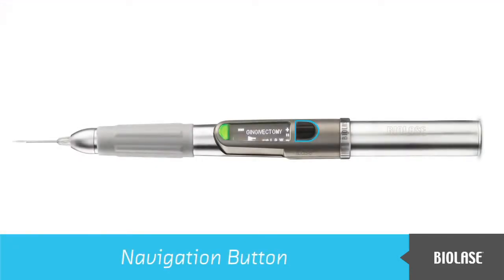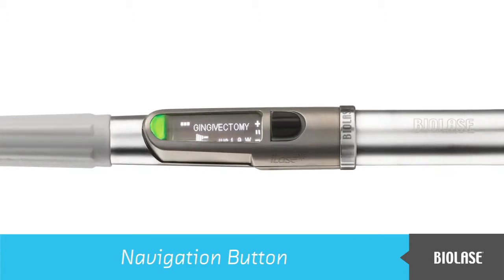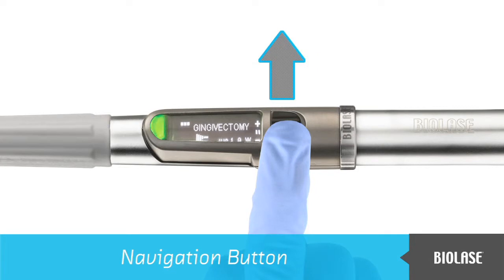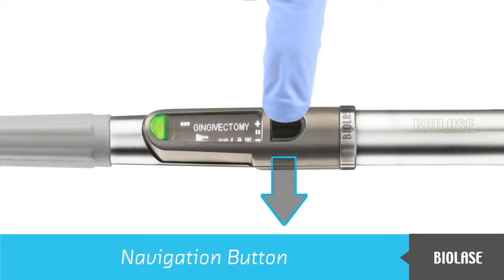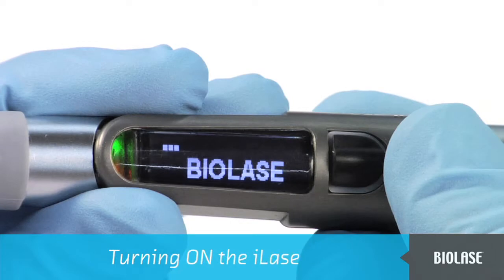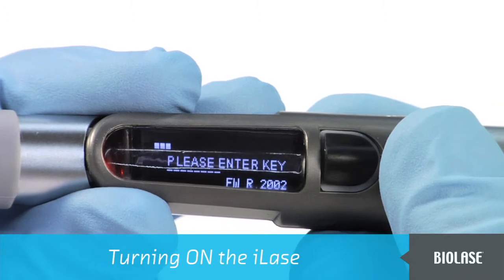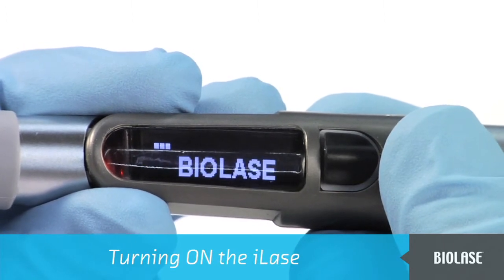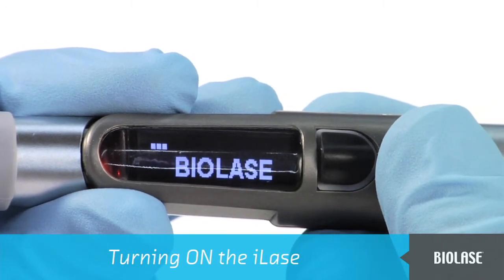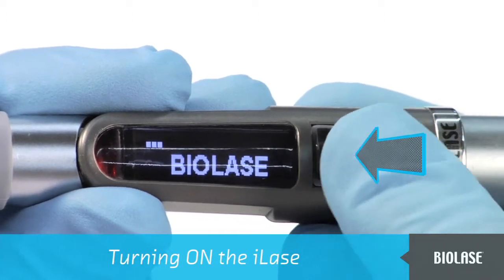Once attached, you will use the black navigation button to control the system. The black navigation button has 3 positions: up, down, and pressing in. Next, you will be asked to enter a key code to unlock the system. If you do not enter the key in time, the system will return to the Biolase screen. To return to the Enter Key screen, simply press the navigation button in 1 time.